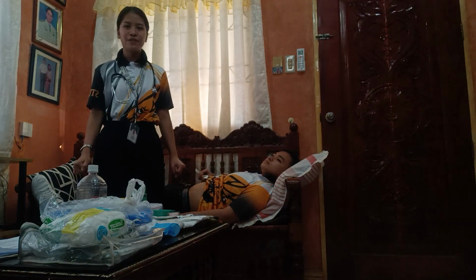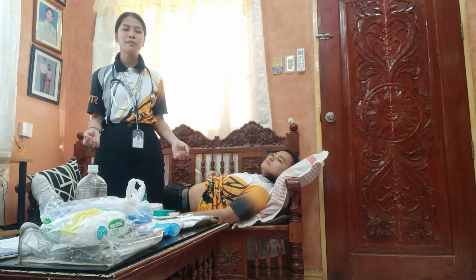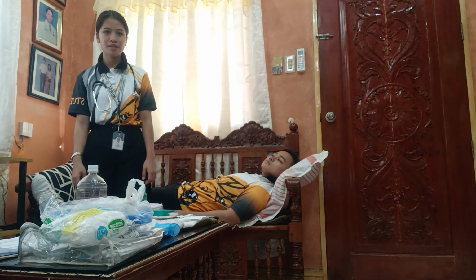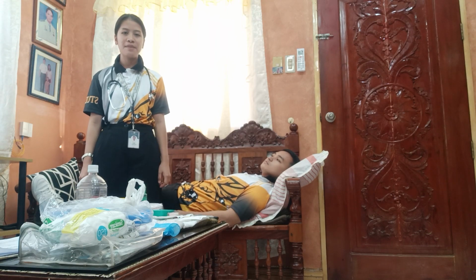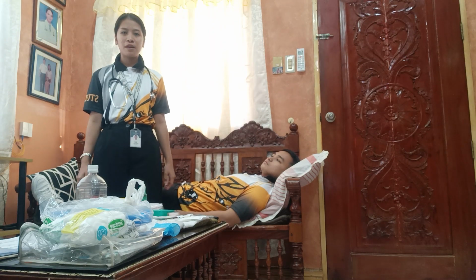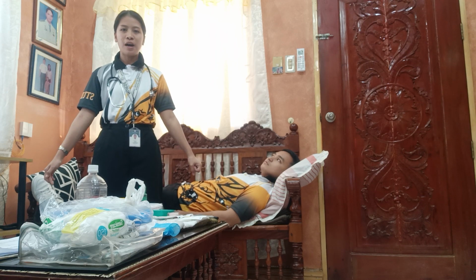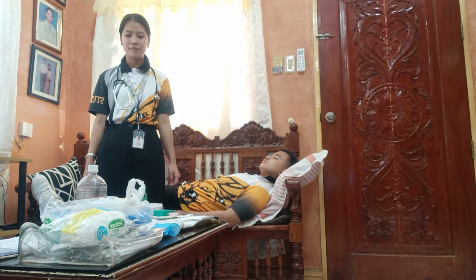Okay. And after po nun, if the abdomen is distended, consider measuring the abdominal girth at the umbilicus to establish a baseline. And next po, let's proceed na po tayo sa procedure. Now po I will verify the medical order for the insertion of the tube. This is to ensure the patient receives the correct treatment.